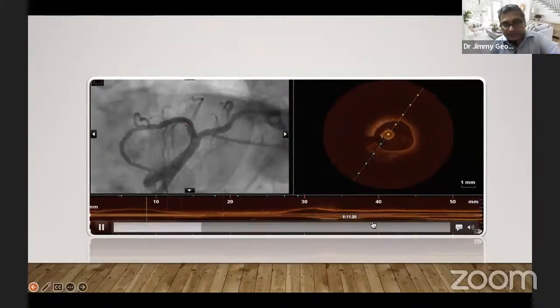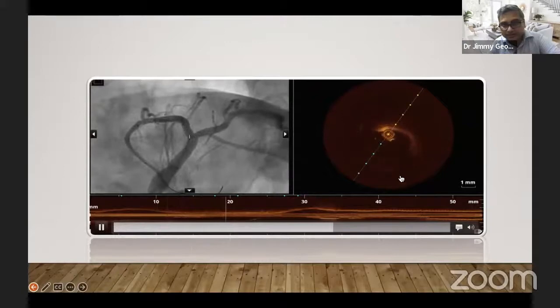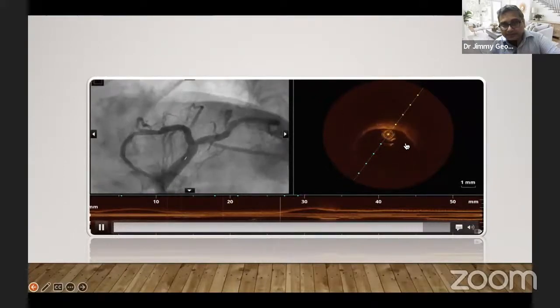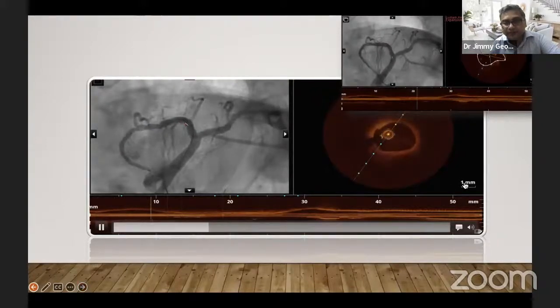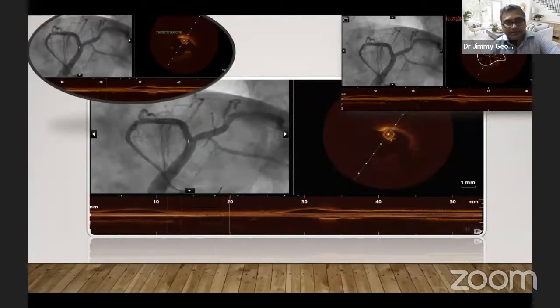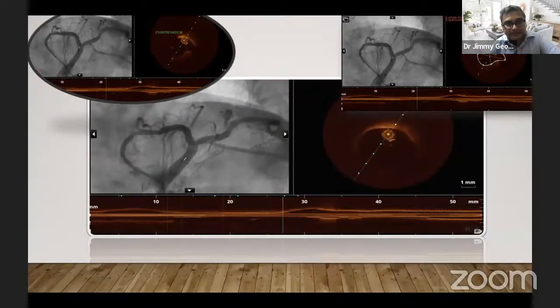Sorry for this, not that clear a picture, but there's some calcification in the mid LAD. And as you reach the co-registered area where the circumflex wire comes out, the LM is roomy. But if you see over there, the lumen area is around 4.58 at the ostial LAD to the distal LM, and some dissected flap is seen at the distal left main.